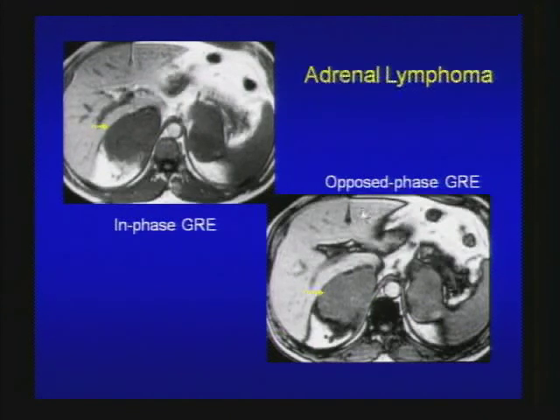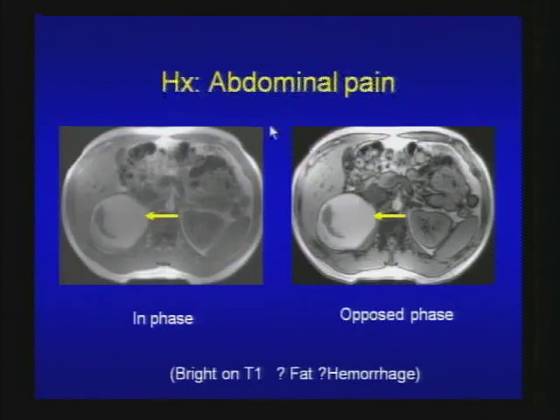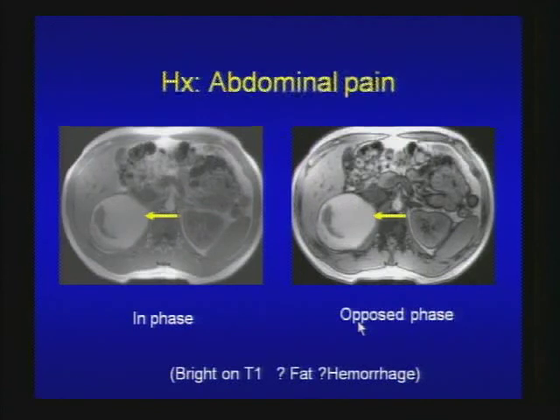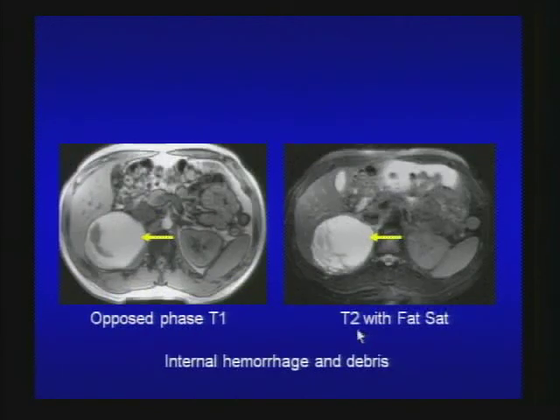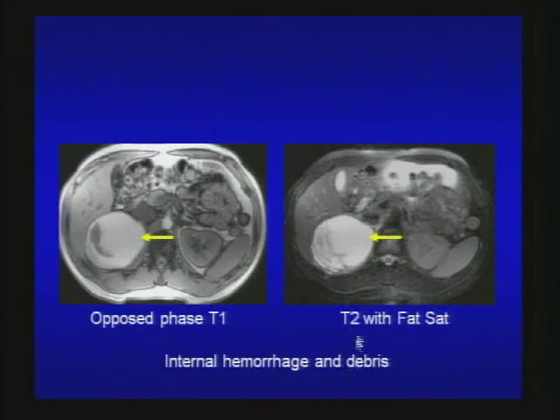The next case is a patient with abdominal pain: large right adrenal mass on in-phase and opposed-phase images — T1 bright. Is it fat or hemorrhage? On T2 with fat saturation it's still persistently bright, so this is not fat. These are internal hemorrhage and debris within a right adrenal pseudocyst. This is the answer to unknown case number three.